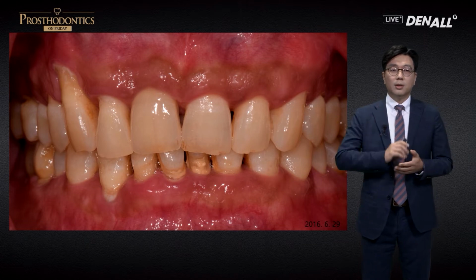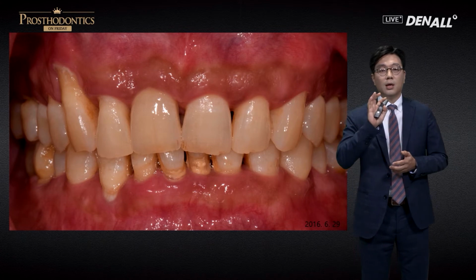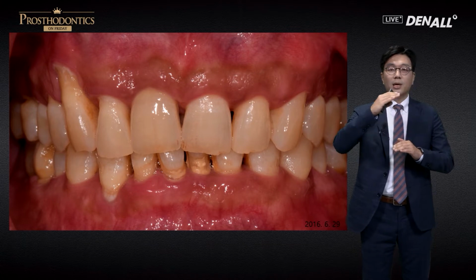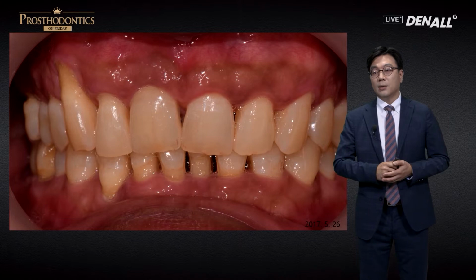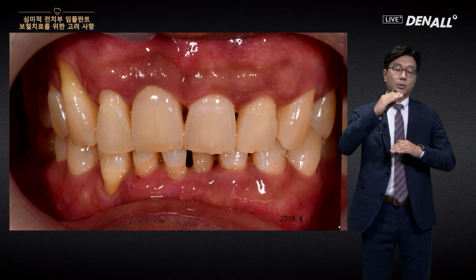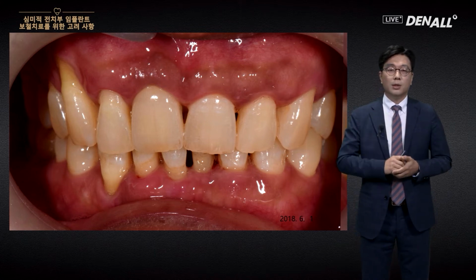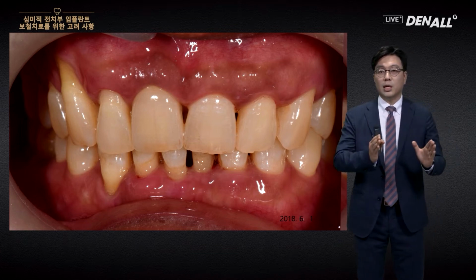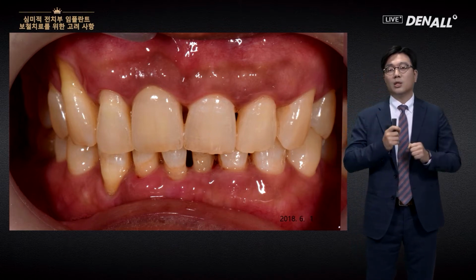During the second surgery, CT graft is done. Over a long period of time, recession is expected. So the ceramic needs to be extended, and that is communicated with the lab. As expected, over time, gingiva had a recession, but the abutment is not exposed, and the shape looks okay. What I want to say here is that white aesthetics can be taken care of by the lab, but the overall situation, we need to identify and communicate a lot about that with the lab team.